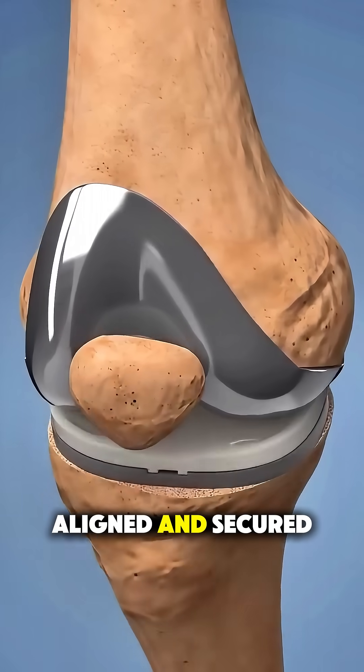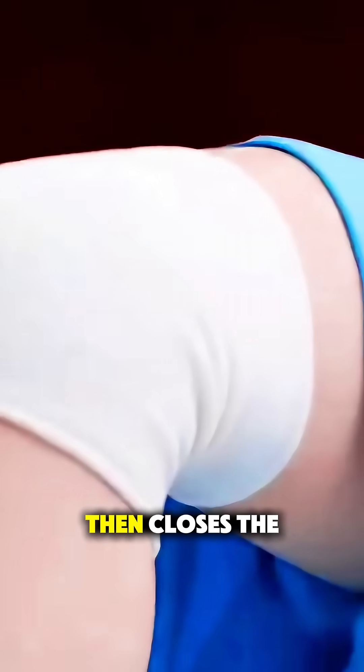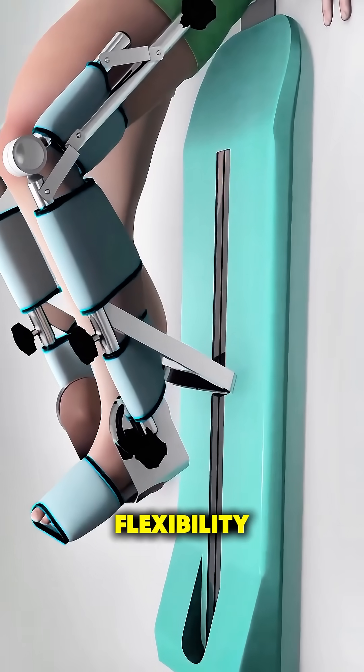Once everything is aligned and secured, the surgeon checks the range of motion, ensures stability, and then closes the incision. The patient begins physical therapy soon after surgery to strengthen the muscles and improve flexibility.